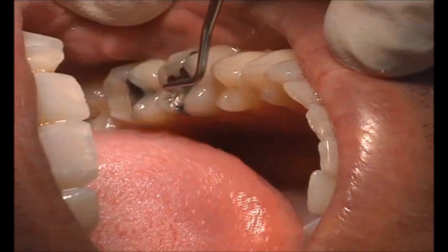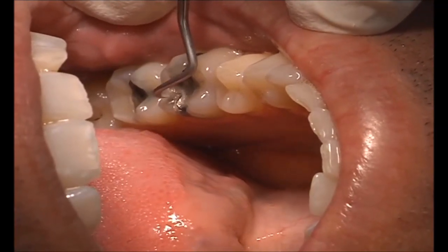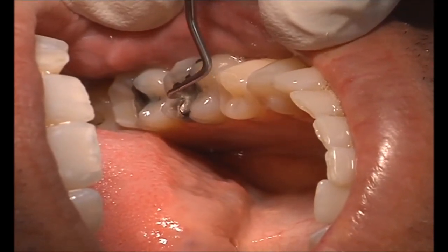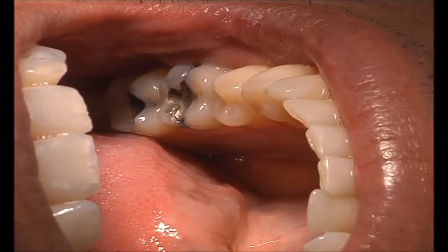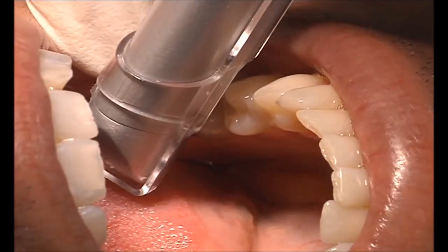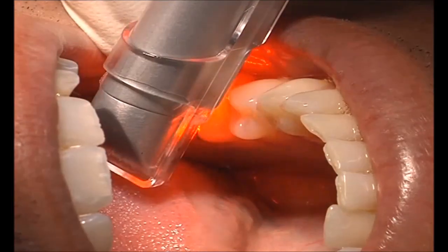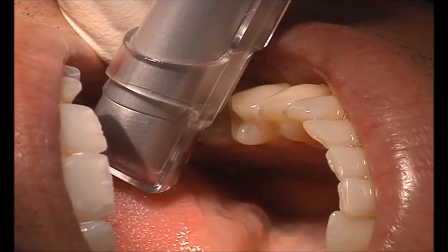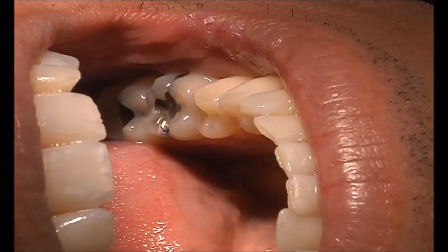As you can see, there is an amalgam on the occlusal surface of this tooth, but on the distal lingual, right in through here, there's some very dark shadowing. I'm going to scan that area to see whether it is decay or not. I'll bring the Canary in onto that area, put my beam straight into that area, and scan. 52. So there is definitely decay around that restoration.